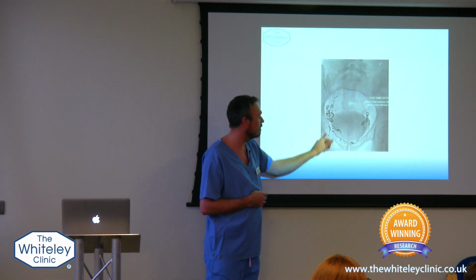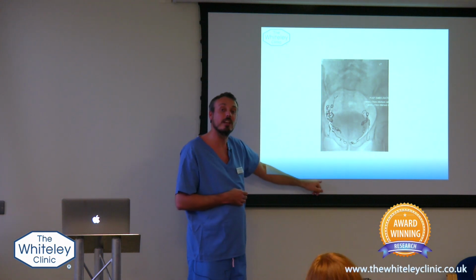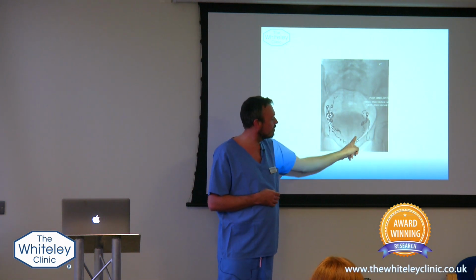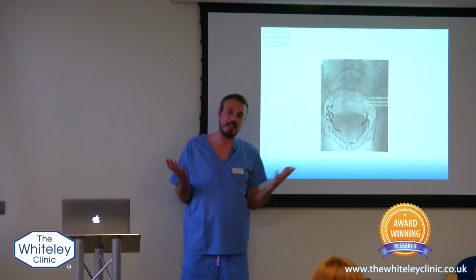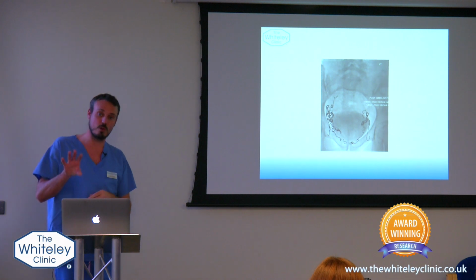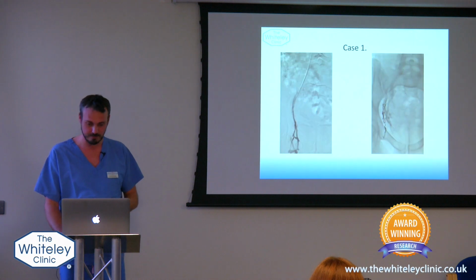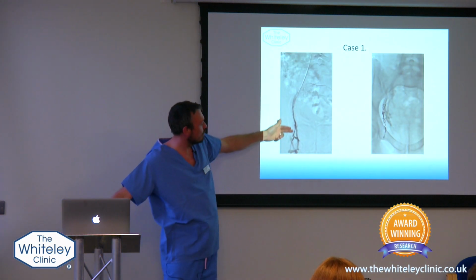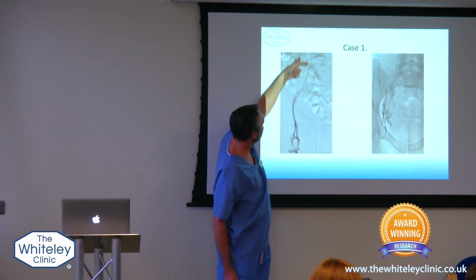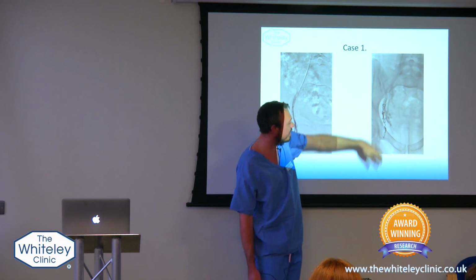This is called your obturator foramen, and there's a high frequency of obturator veins spilling down onto leg veins. The ones that come underneath this dark structure here, which is the bladder, tend to be the pudendal veins. And it's the pudendal veins more than the obturator veins that would cause problems with pelvic congestion syndrome, and the ovarian veins. So this, for example, is the obturator vein coming down, and this vein will then join onto the leg. So through this tiny tube that goes all the way down, we've placed the black coil. This is the black coil there. That then sits in the vein.